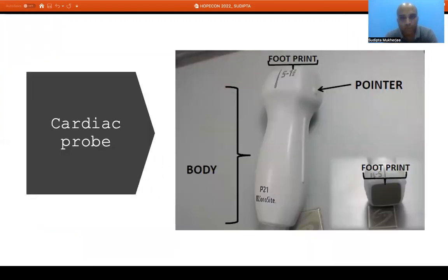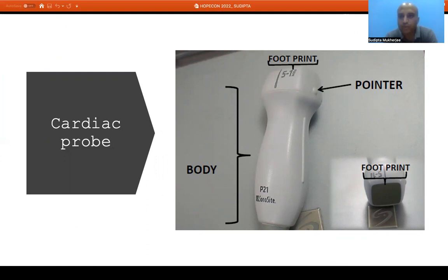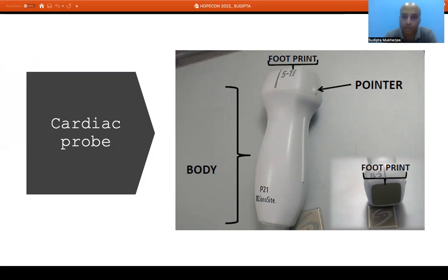Next is the cardiac probe, because we need to rule out a cardiac cause of hypoxic respiratory failure. For this we use a phased array probe, which has a small square-shaped footprint, so it can be accommodated within the intercostal space. Ultrasound waves cannot pass through bone because of the large change in acoustic impedance — all waves hitting bone are reflected back. That is why during echocardiography we have to bypass the rib shadow.